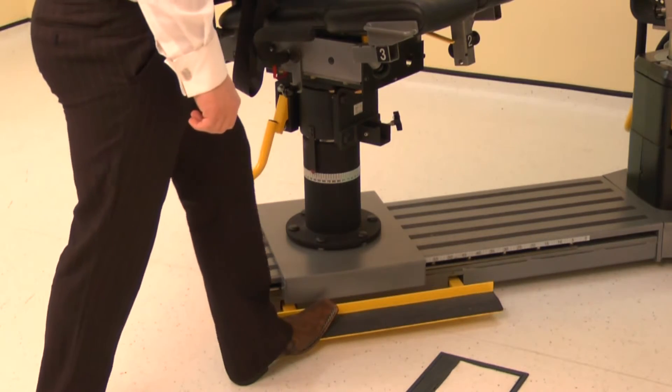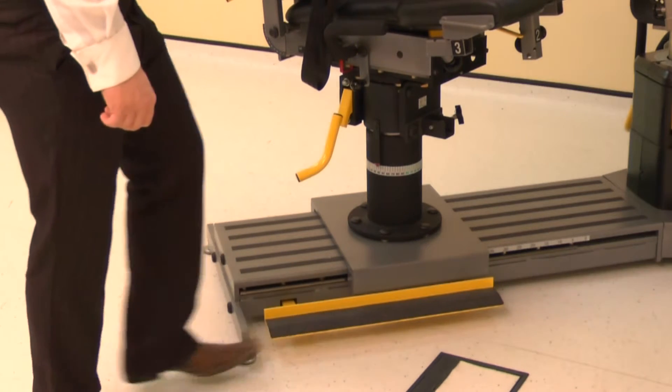Finally, position the monorail by pressing the kickboard and sliding the chair to position 75.